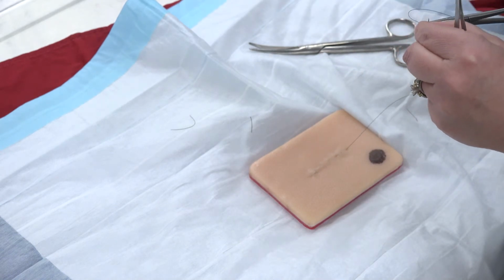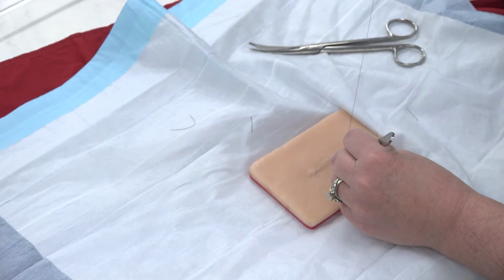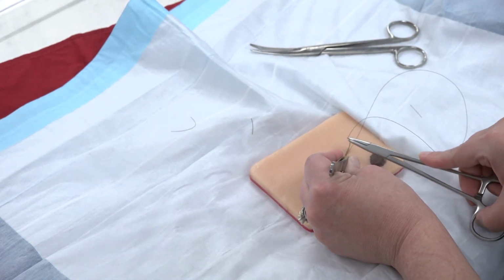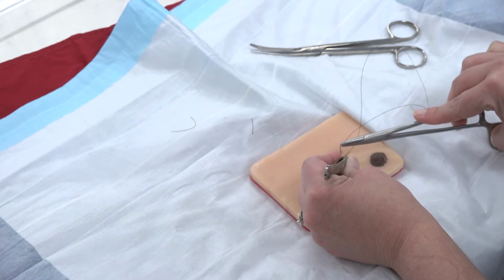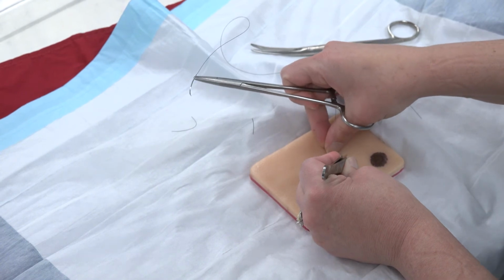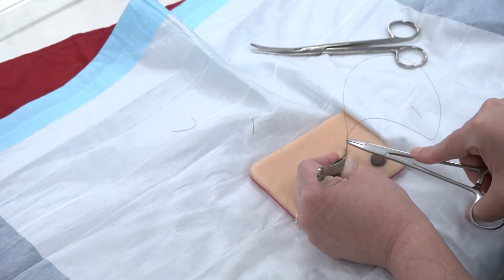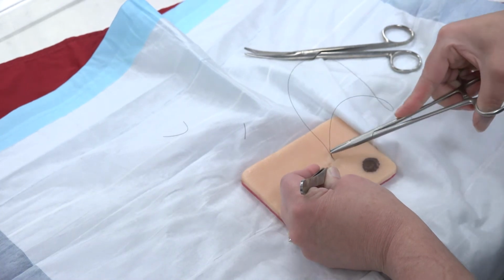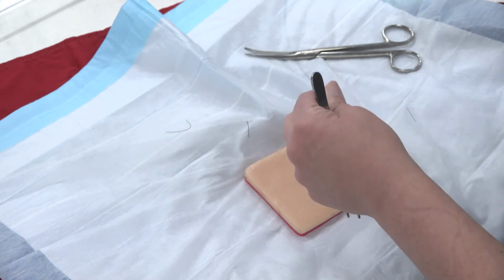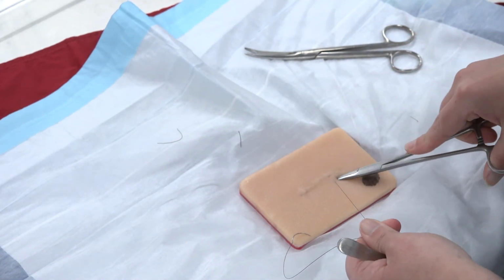So now, if they're sticking up like that and it didn't completely turn upside down, what can I do? Well, I can smurf it. So what I'm going to do is I have to go in the same hole. If I come in just adjacent to the hole, then this is going to be over the top of that tissue and diving in, so it's going to be pulling the knot up. You have to go in the exact same hole and then out of the skin, deep to the knot, and then it flips the knot upside down.